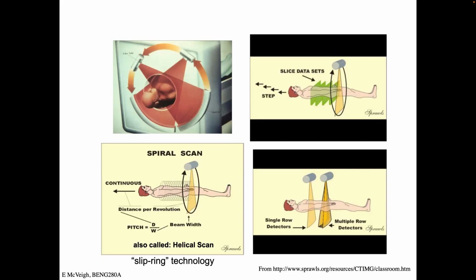That works really well, that helical scanning, unless you're imaging something such as a heart when it's arrhythmic. So if you need to make an image of an object, but that object is continuously changing from beat to beat, so if one heartbeat doesn't equal the next, it looks different as you go down through these helical spirals, and it causes artifacts. Another way of doing it is just to step the patient through. And this is done when you have a wide detector and you want to do the whole body. Sometimes you push, say, 16 centimeters, take a picture, go another 16 centimeters, take the next picture, go another 16, take the next picture, as opposed to doing a continuous helical acquisition.